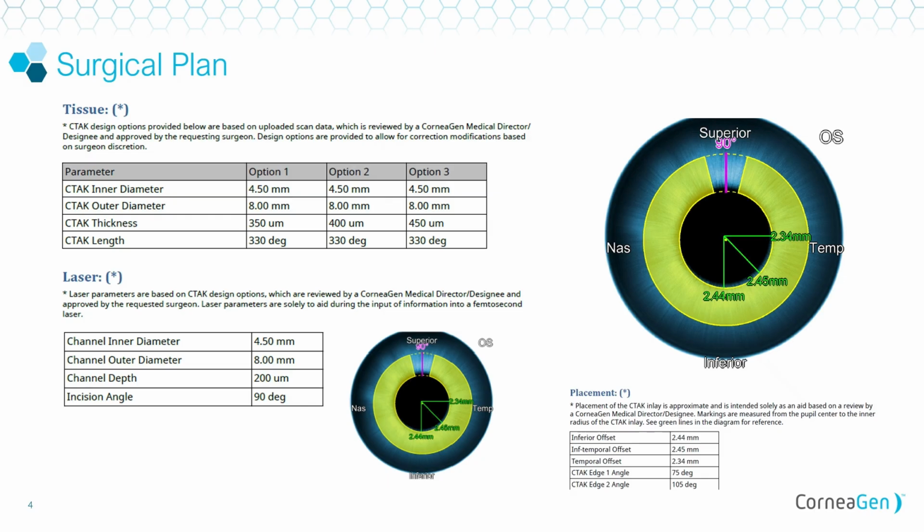If on the other hand I have a patient that's mild and their spherical equivalent is a diopter, 2 diopters on the minus side, I might not want to go with the recommended or with the very thick. I might want to go with something a little bit thinner, because you don't want to shift it. You want to flatten the cones. You don't want to shift these patients into hyperopia, right? That can be problematic. So that's the option that you have there as a surgeon.